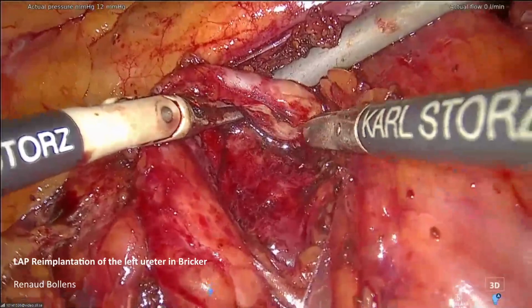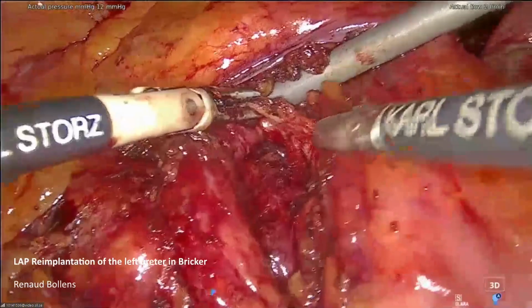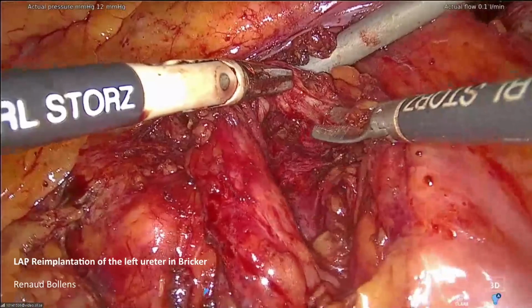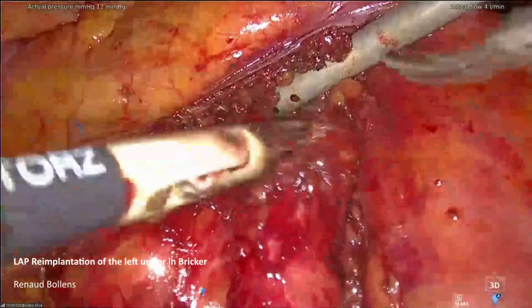And here I can hold it with my grasper, because it's not a part that I will preserve. And it's really fibrotic and white tissue, then it's a very bad quality. Okay, at one moment I will need to return from the other side to see if I can find my ureter on the other side from the mesocolon. But it's a very stiff tissue, really fibrotic and very adherent. Okay. Once again, I just want to cut here.